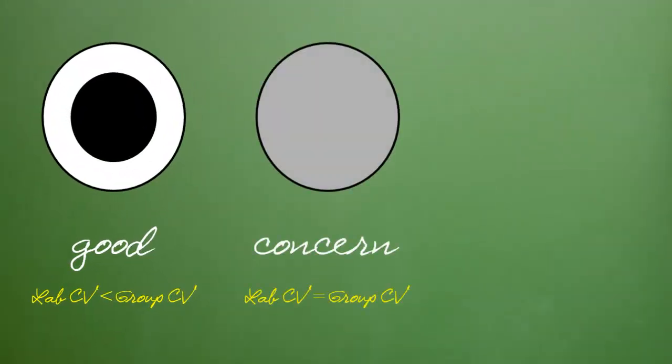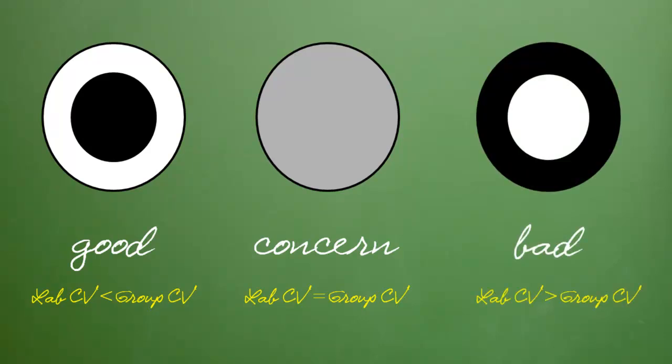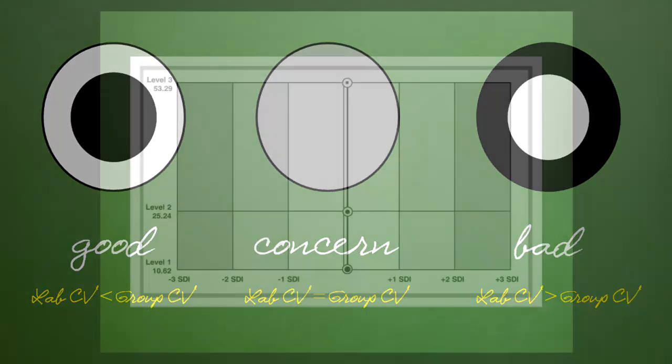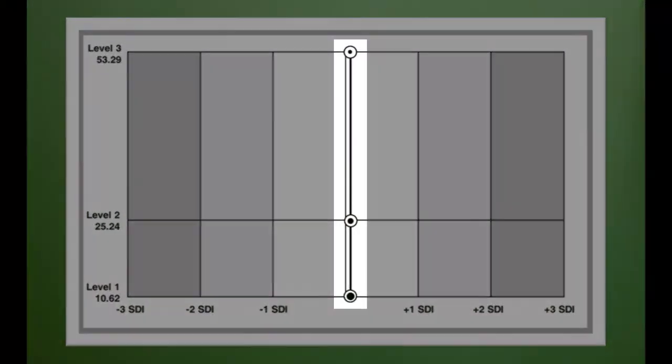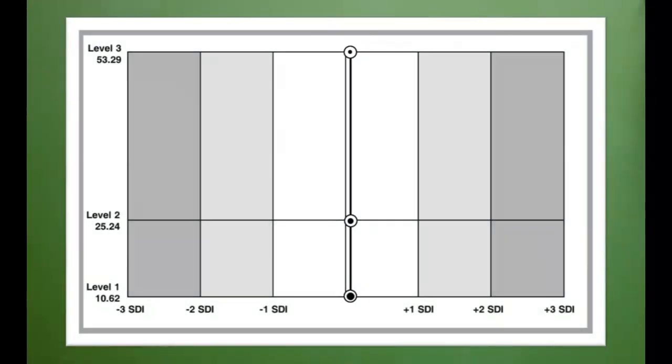So, to review. Control levels that look like donuts are good. Levels that are gray might make me sad and concerned. Levels that look like old tires might be bad. In this example, I have a donut shape for all three levels of control. So, I'm doing fine. Note that I have more donut at level 3 than at level 1.